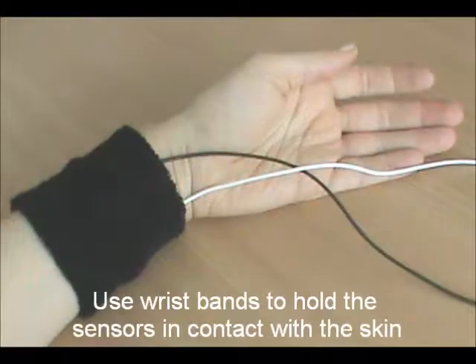If you're using the reusable snaps, you need a means of holding the sensors in contact with the skin. For the wrist placement, the best way is to use a pair of wristbands. Simply tuck the sensors inside with the flat surface in contact with the skin. For the forehead placement, you can use a headband.